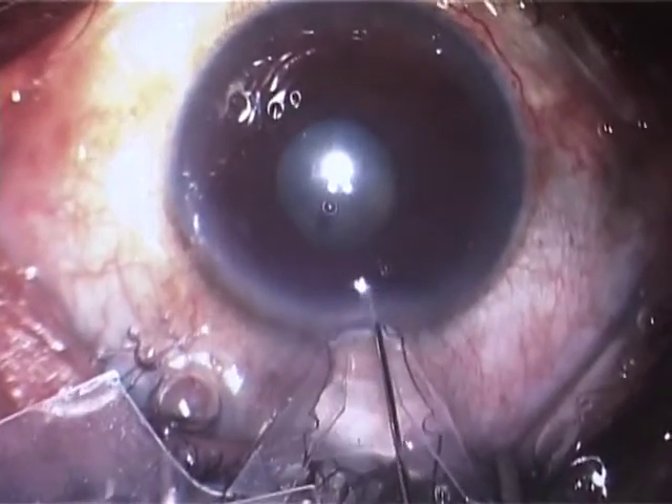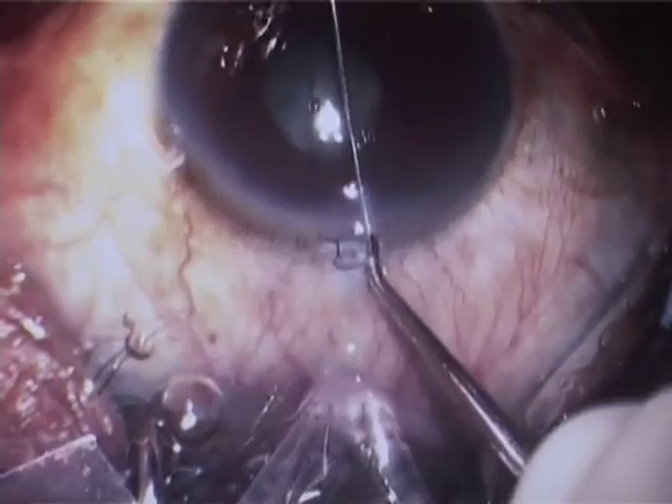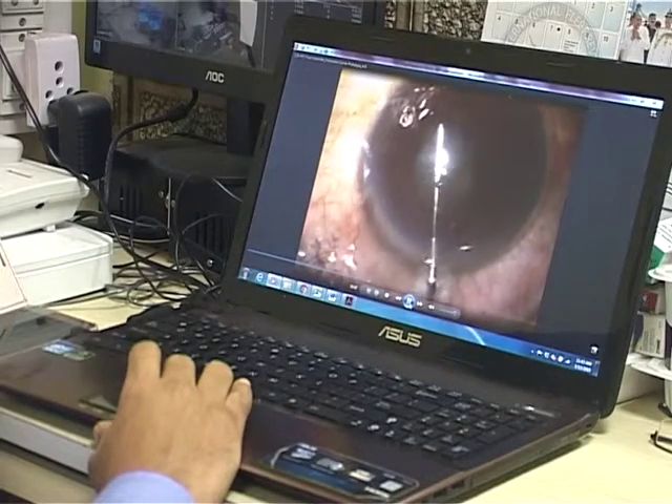This expander is pre-loaded in a carrier and held sterile at the incision, so the surgeon simply needs to slide the device into the eye with a simple Leicester manipulation.